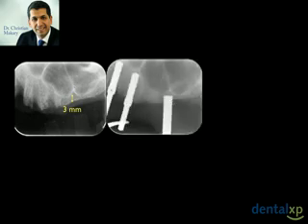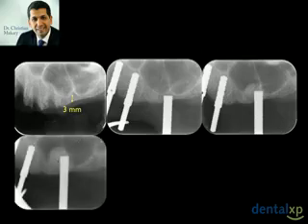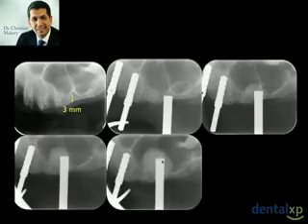So by the use of an osteotome, you can see that this osteotome went 2 millimeter into the bone. By adding some biomaterial and tapping smoothly, you see how we start lifting the membrane, and the bone is very well compacted and very well gathered beneath the membrane, because once again of this dome-like effect that you can see here. It's going more up, and now the osteotome is going from 2 at the beginning to 6 millimeter into the sinus. And here the osteotome went 8 millimeter into the sinus, and we see the huge amount of bone that is gained, and it's still very well protected by the membrane.